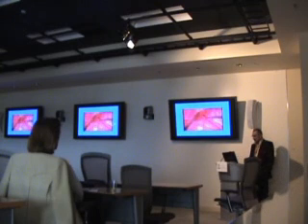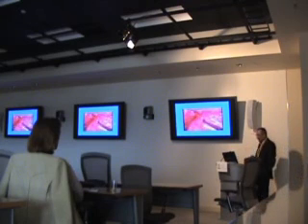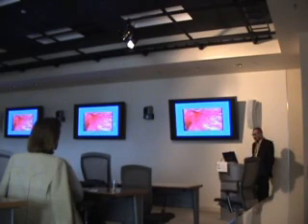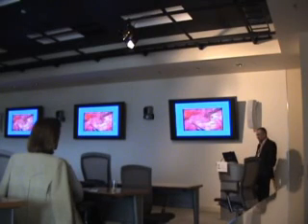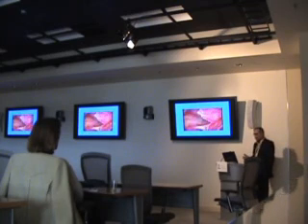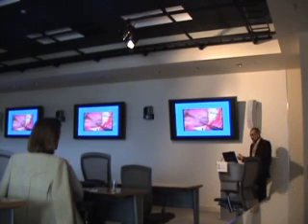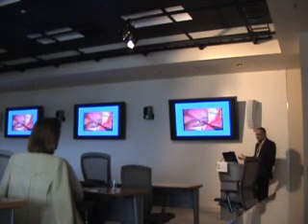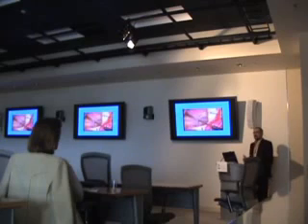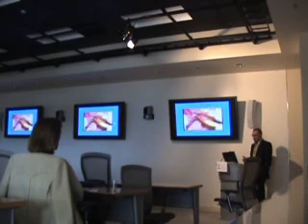Comparing this with the live cadaver model, you can see there is bleeding, you need to suction, you need to deal with the bleeding. Even though the tissue doesn't look alive, there is something of live surgery: opening the dura, opening the arachnoid, releasing the CSF. All of these are important simulations that you need to deal with in order to practice and to learn a surgical procedure.